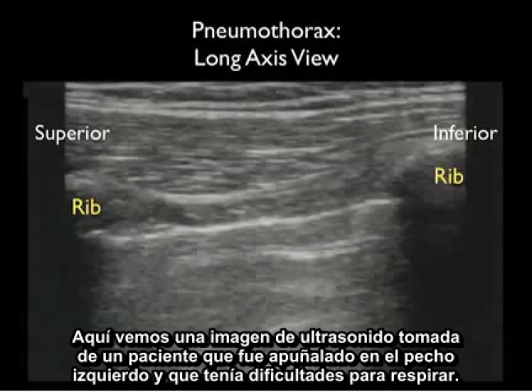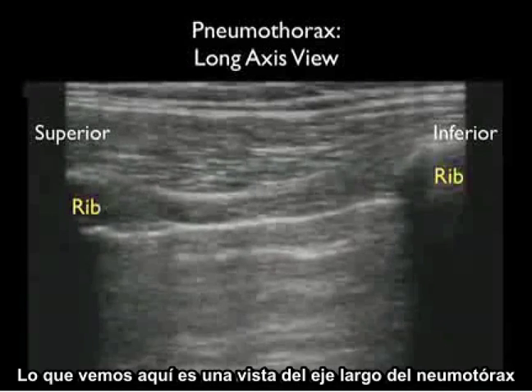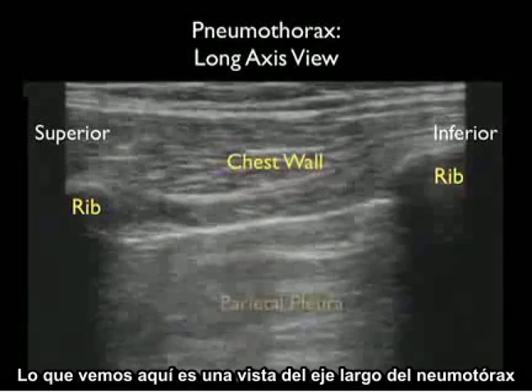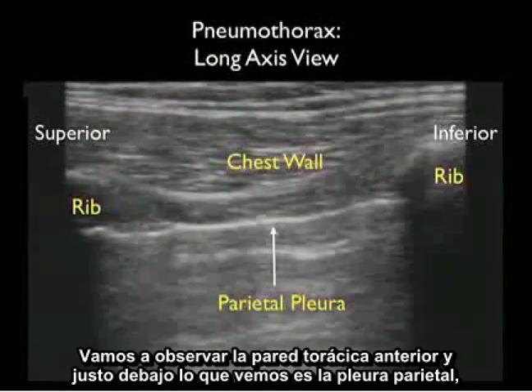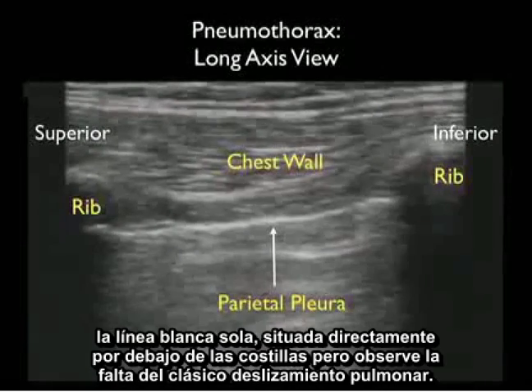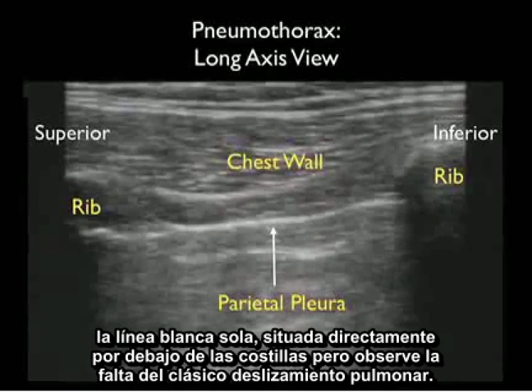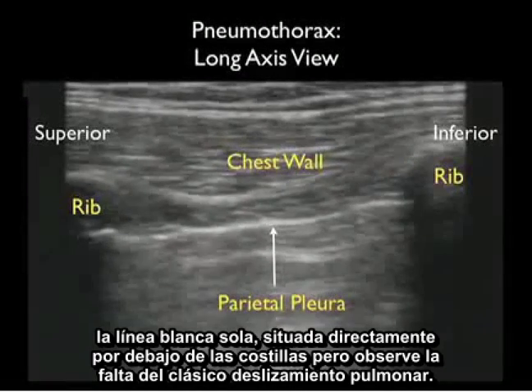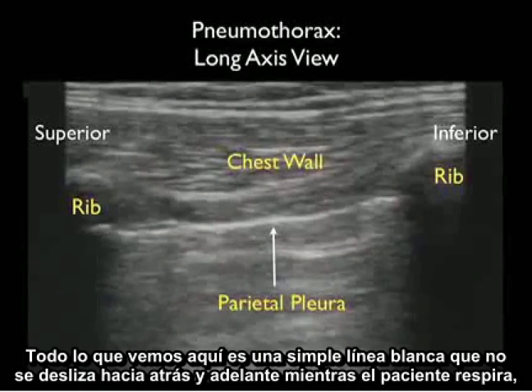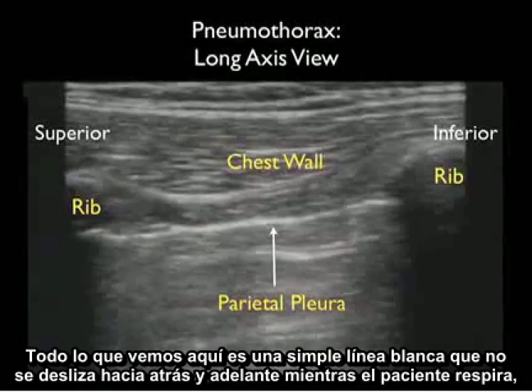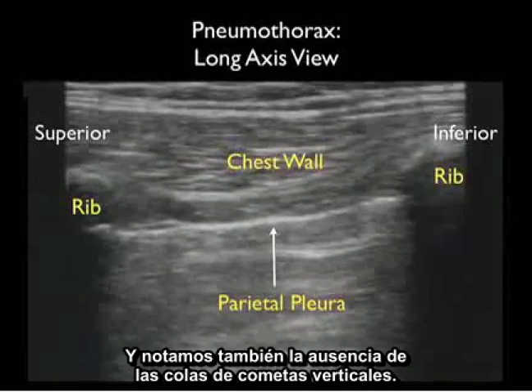Here's an ultrasound image taken from a patient who was stabbed to the left chest and had shortness of breath. What we see here is a long axis view of a pneumothorax. Looking at the chest wall anteriorly, right below that we see the parietal pleura — the single white line located directly inferior to the ribs — but notice the classic lack of lung sliding. All we see is a single white line that fails to slide back and forth as the patient breathes. Notice also the absence of the vertical comet tails.